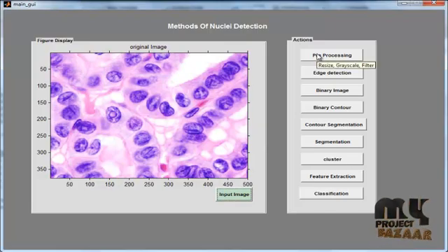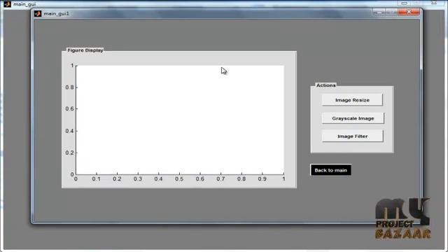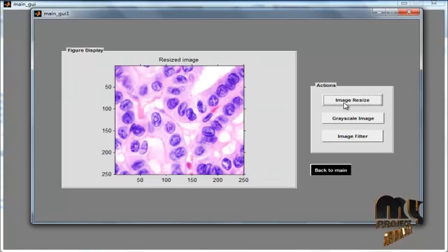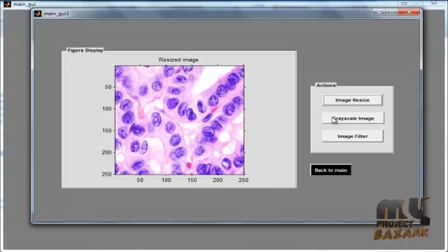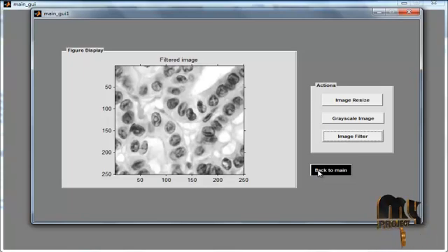Then click the Pre-processing button. After clicking the pre-processing button, another GUI window opens. In that GUI window, we can see three buttons: image resize, grayscale image, and image filter. By clicking image resize, we can resize the image to 256x256. Then grayscale conversion is undertaken — the image becomes a grayscale image. By clicking the image filter button, we can remove the noise from the image. Then click the button Back to Main.